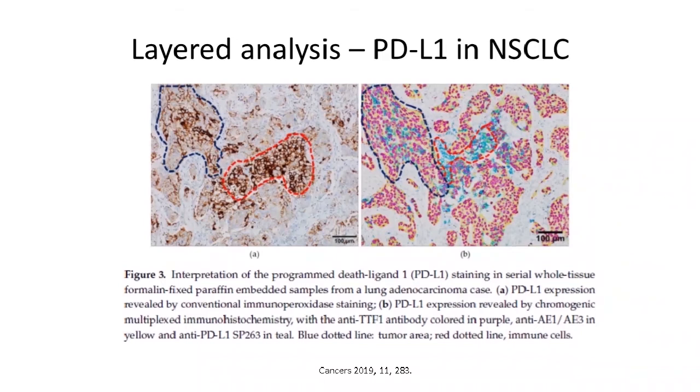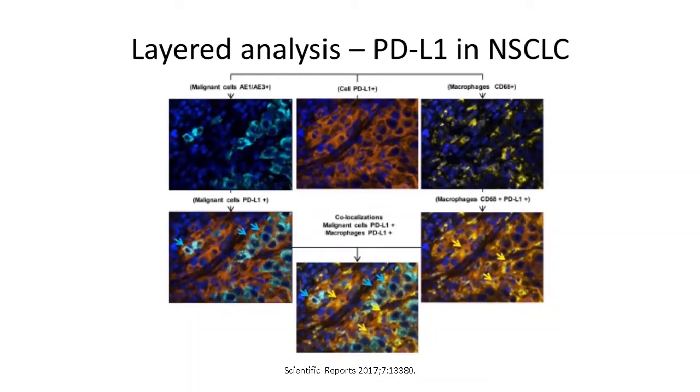So it would be good if we could actually combine PD-L1 staining with, for instance, here on the right in pink, the TTF1 stain, and also in yellow, the pan-keratin stain. So here we can see by using this multiplex approach with these three different stains of PD-L1 and also the keratin and TTF1, that this is tumor and this in fact is an area of immune cell infiltration, which by using PD-L1 alone is very difficult to distinguish. So this is a potential application which I think we'll see more and more of in the years to come.